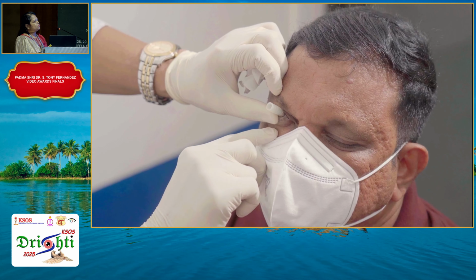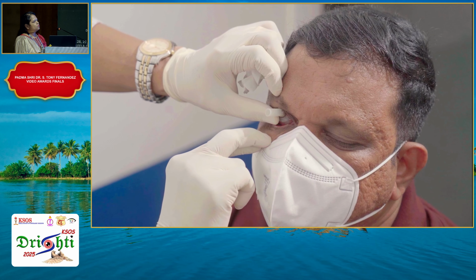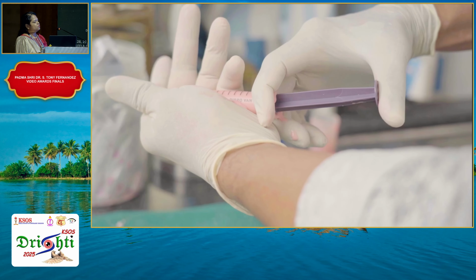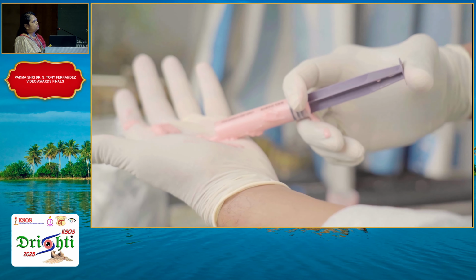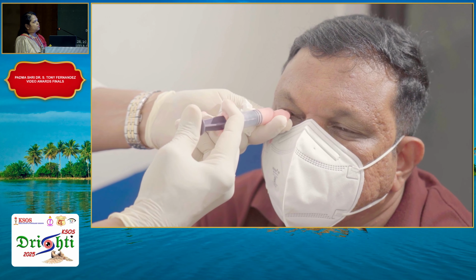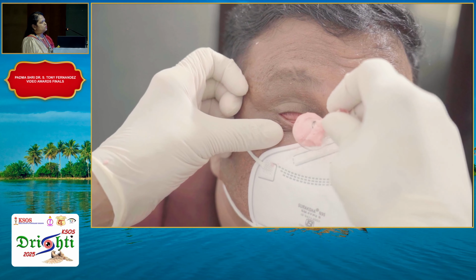The alginate impression of the socket. An impression tray is selected according to the patient's socket size and inserted in the socket. A measured amount of alginate with 10 ml of water is mixed into a flowing paste, loaded into a 10 cc syringe and injected into the impression tray, which is kept ready in the patient's socket. The alginate paste fills the entire sac and starts penetrating through the holes of the tray. Once this alginate is set, the impression tray is gently removed from the eye.